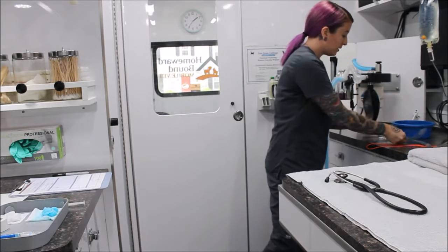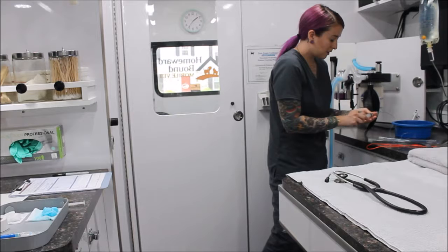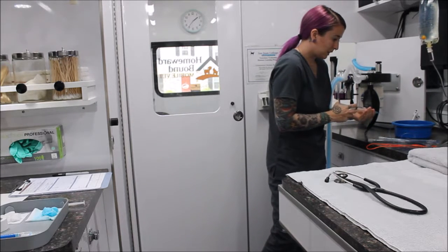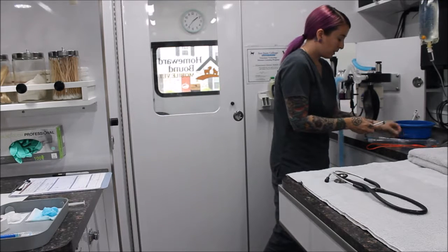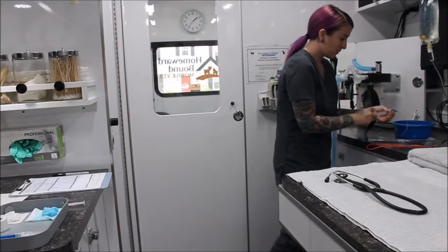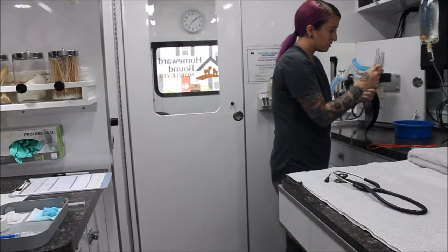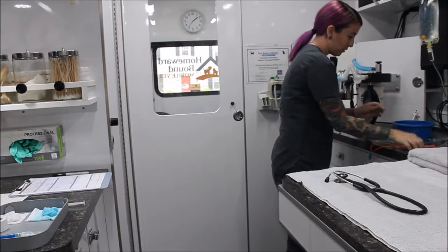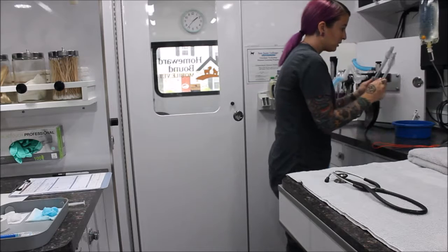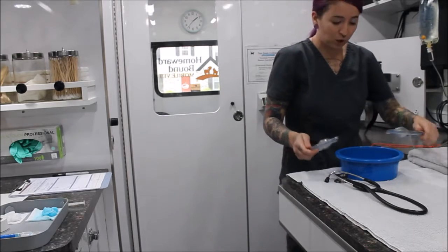So the next thing I'm going to do is I'm going to take my syringe and check my tubes just to make sure that I don't have any leaks in them. So I'm going to inflate them both. First thing I'm going to do is just look at them, make sure I don't see them actively deflating. In fact, I'm going to inflate this one just a little bit more. Everything looks good. So the second way I'm going to check them is I have a bowl of water here.